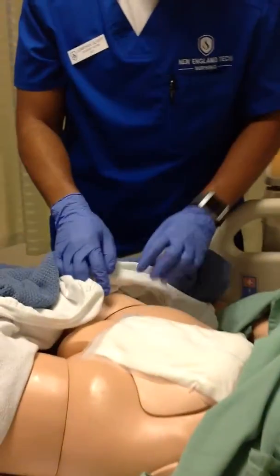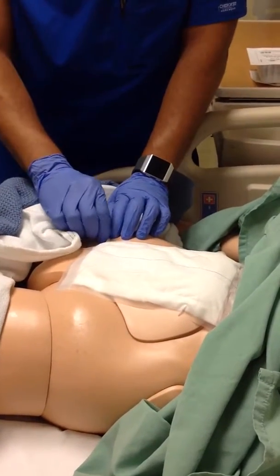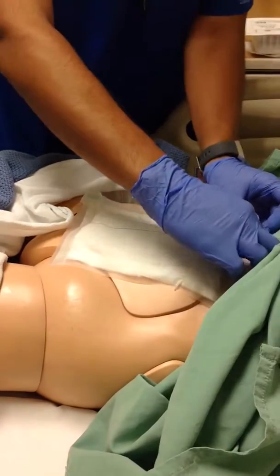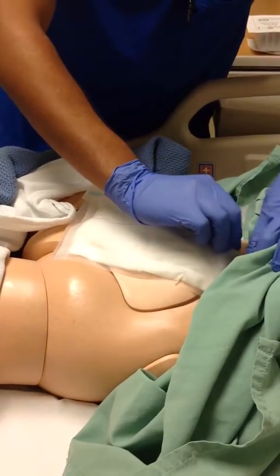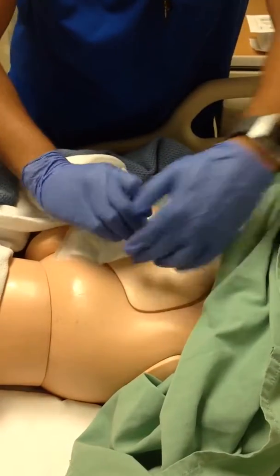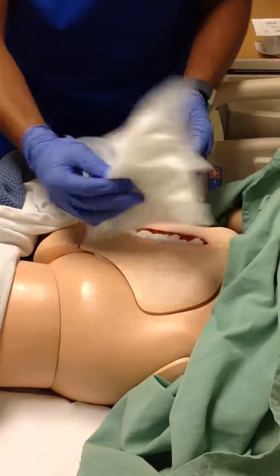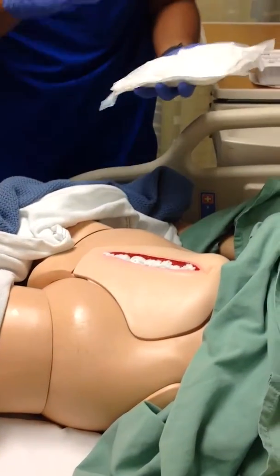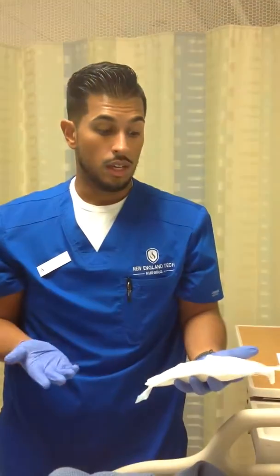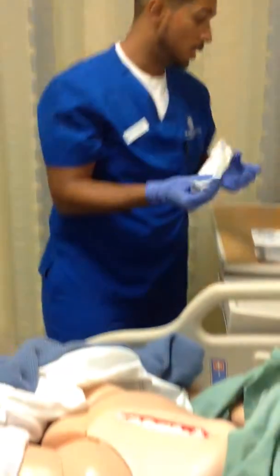patient's dressing. The abdominal dressing has been taped down, so I'm going to hold on to the patient's skin and pull the tape in the opposite direction. And I would do that to the entire surrounding of the dressing. I would then remove the patient's dressing, and I would analyze for any drainage. If there is drainage, I would want to know any color, the amount of drainage that there was, and if there was any odor. Then dispose of this.